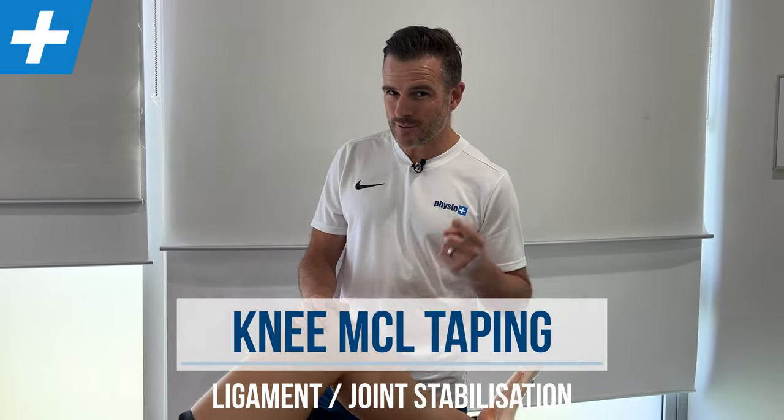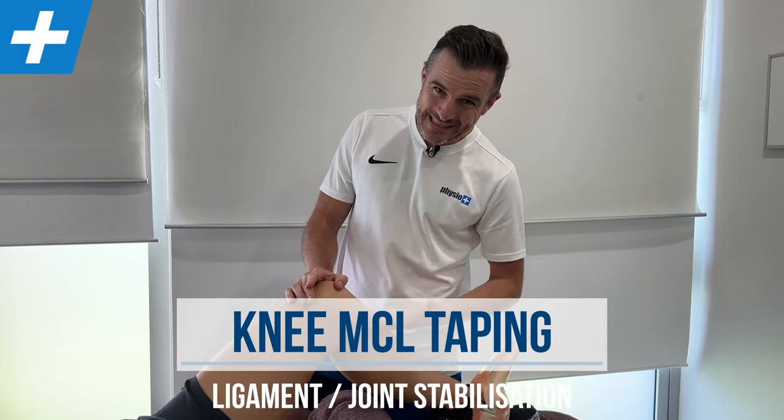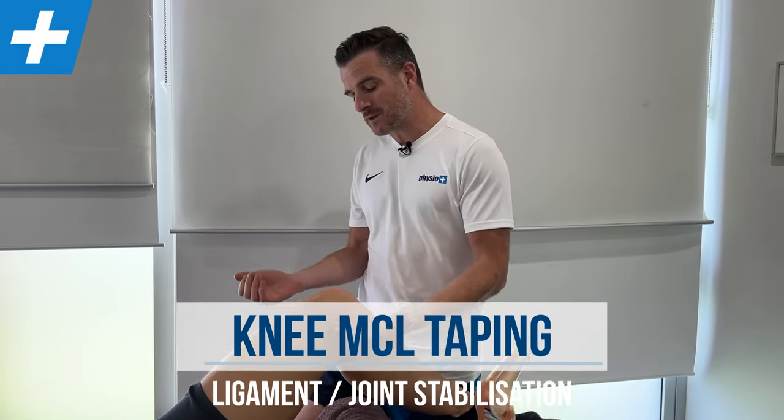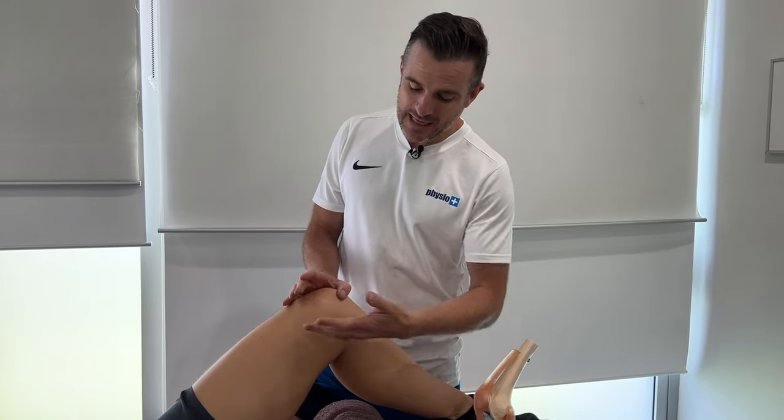Today's taping session is for the MCL, the medial collateral ligament, which is the ligament on the inside of the knee. There are two collateral ligaments — one on the medial inside, one on the lateral. The good thing about today's taping is we're going to show you medial, but if you've got a lateral injury, you can do it for the lateral side as well. It's pretty much the same.